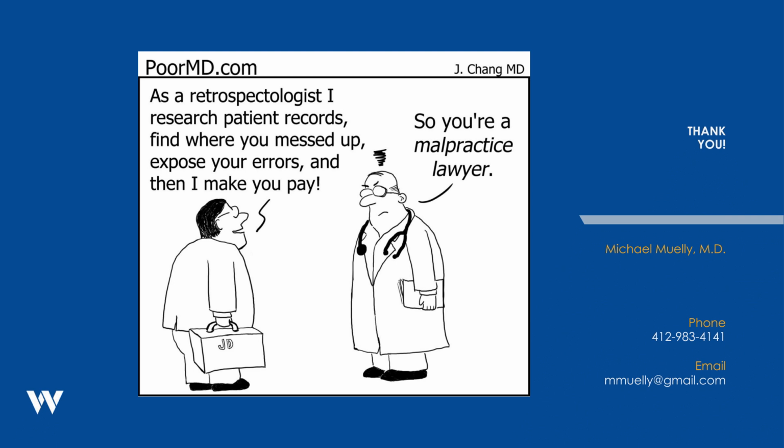This brings me actually to one more clinical point, which is documenting. So you can typically store images and send images to PACS from your fluoroscopic device. So if there is something unusual, something where you need to demonstrate that patient had a finding, for example, with the joint laxity or the ligamentous rupture, you may want to document that.